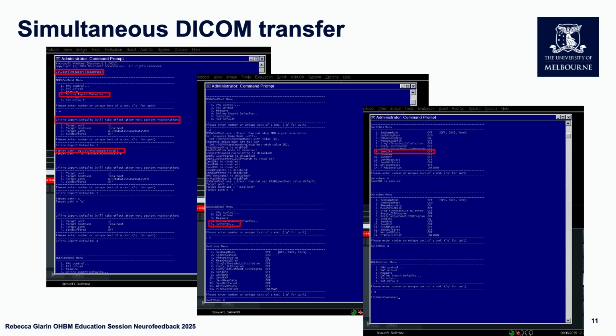want to add in distortion correction or you want to collect your phase data as well, as Amir mentioned, you need to consider the number of your DICOM, and because you've got this automatic transfer on, the minute you change something on the scanner, you might collect physio logs or something, it will change the numbers of your sequences, and that will then change the number of the DICOM that you want to be receiving. So just be aware that once you switch this on, it's sending everything, and it can potentially mess some things up.